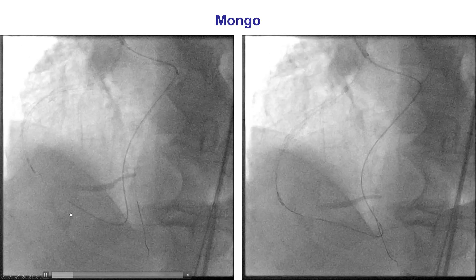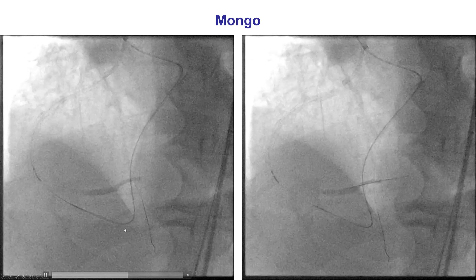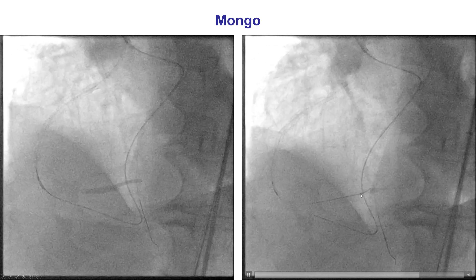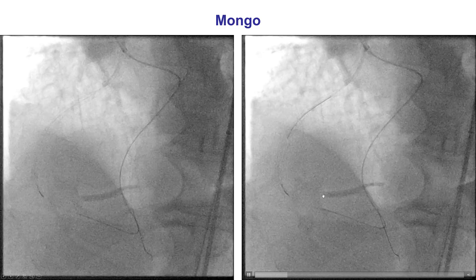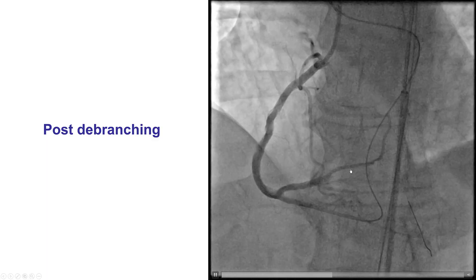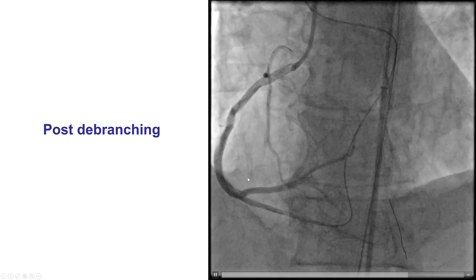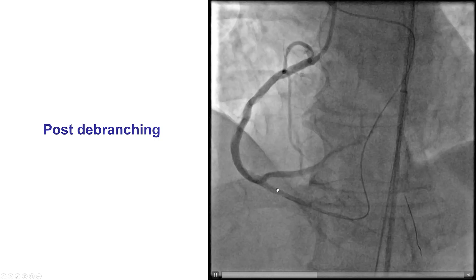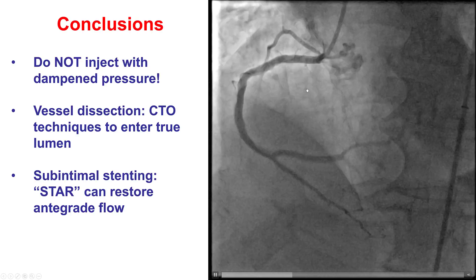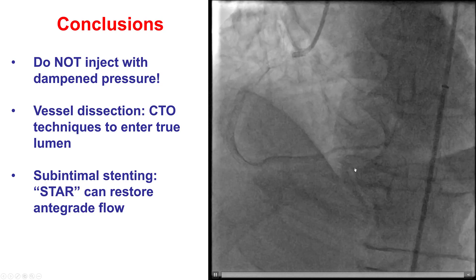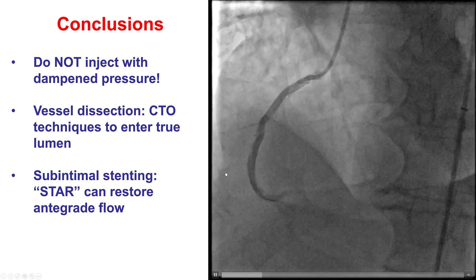What we ended up doing is getting a polymer-jacketed guide wire, the Gladius Mongo. We then did essentially de-branching — we advanced the guide wire distally both into the PDA as well as into the posterolateral. After doing that, the contrast that was present there drained, and that actually restored antegrade flow into those branches. We did not place any more stents. Essentially, what we did is the STAR technique using a polymer-jacketed guide wire — we also knuckled it and advanced it further down. We did get a nice result in the end with TIMI 3 flow in both the posterolateral and the posterior descending artery. There's still some dissection lining the distal RCA, which we decided not to treat.